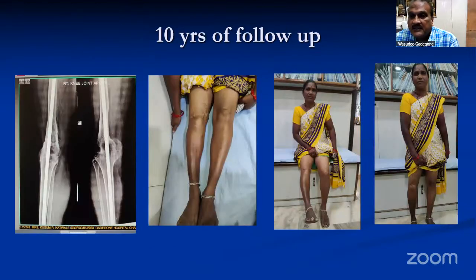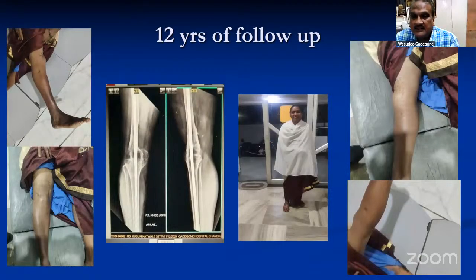And then you can see 10 years of follow-up. There is a complete solid union between the tibia and femur, and still nail is in situ, and she can walk, she can go anywhere, and you can see this is the 12 years follow-up. She is able to do all activities of daily living.